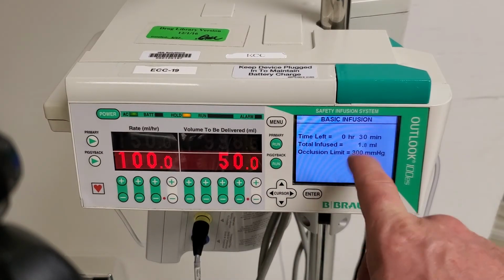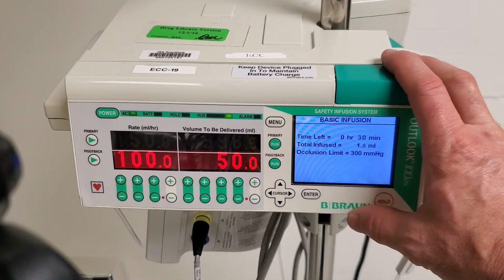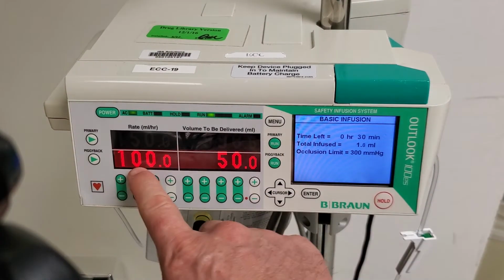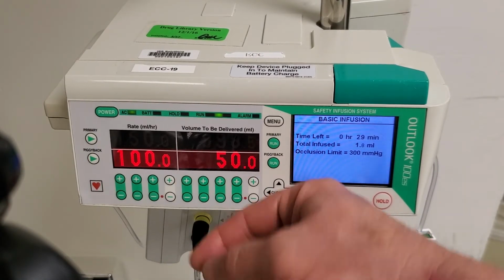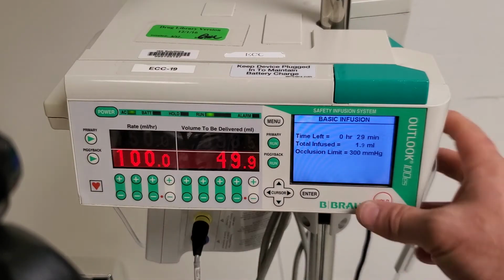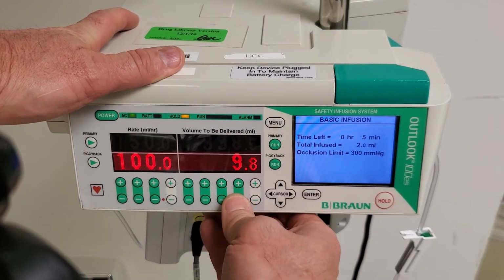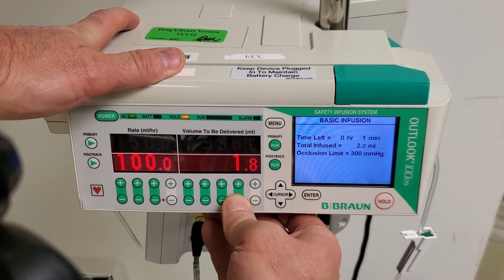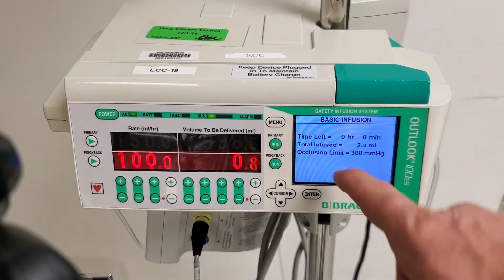Notice that gives us a 30-minute infusion. We hit the run button, and now that's running. It will run the secondary infusion at the rate for the volume to be delivered, and then it will automatically revert back to the primary infusion. So I'm going to change my volume so that we can see how that happens. Once this is complete, you'll notice that the pump reverts back.